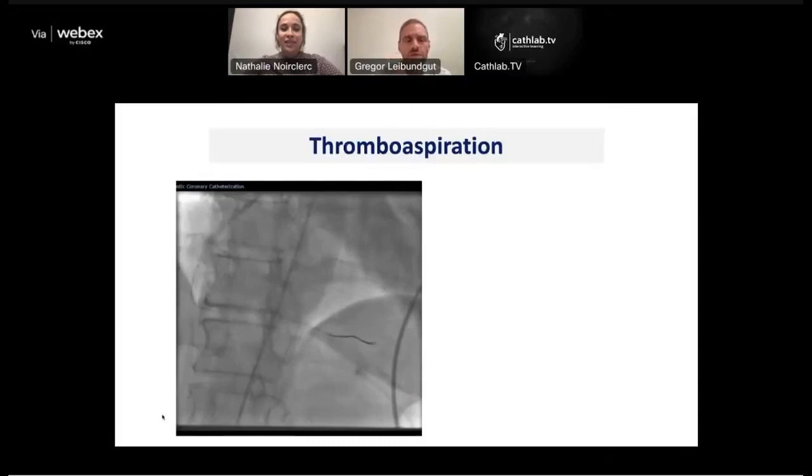If you're in a very small branch, it's like being in a microcatheter. The wire is restrained. It cannot move sideways like in a big vessel. And then the tip load becomes exponential. It can be 40 times the tip load. If this is a tip load of 1-point-something gram, it can be 40 grams. This is an atherectomy-like penetration wire.